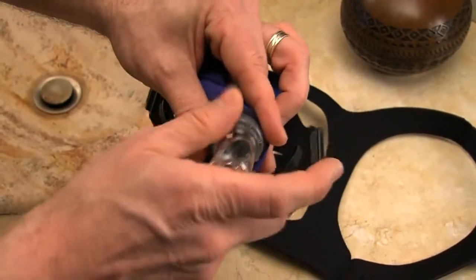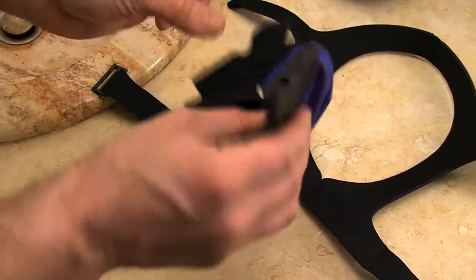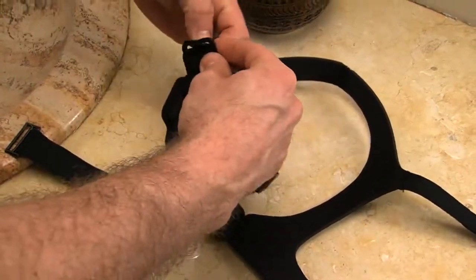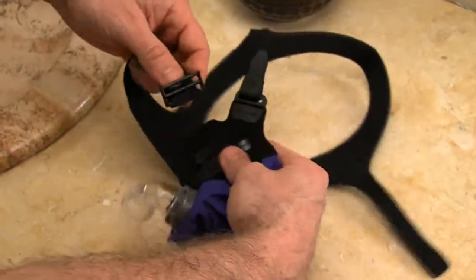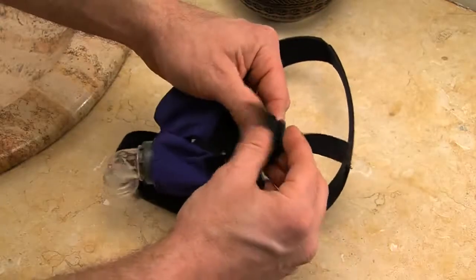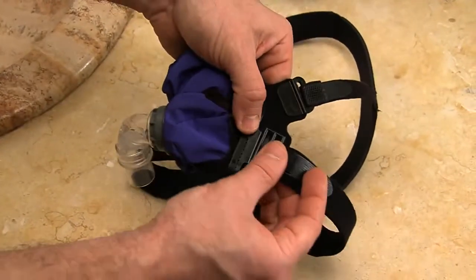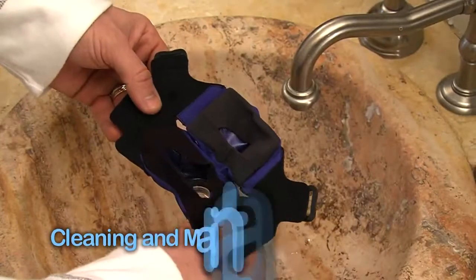To attach the headgear to the mask, lay your headgear flat with the product label facing down. Lay your mask bottom down. Attach the top hook tabs through the top slots of the mask. Snap the male double clip into the female quick release clip on the mask. Make sure each side is firmly attached. Note: keep all straps open to the widest position. Your mask is now ready to put on.